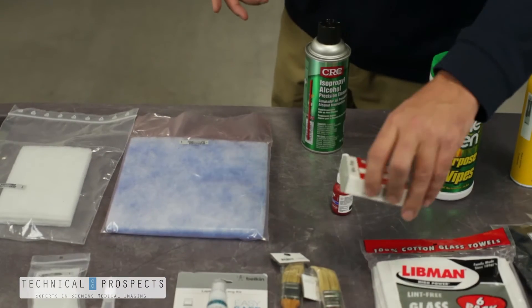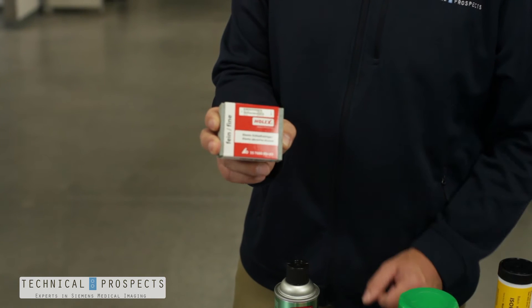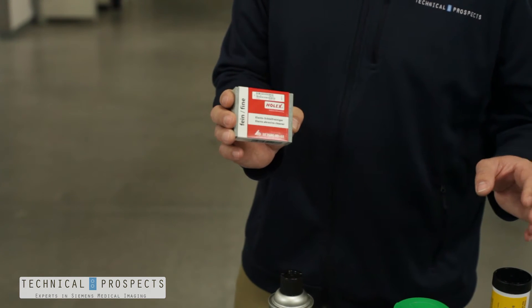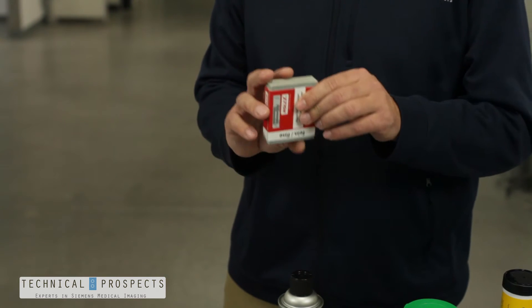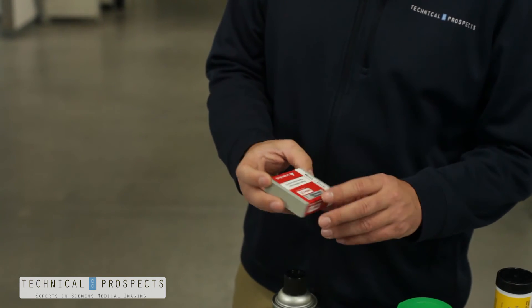A great tool for a Siemens scanner is this abrasive cleaner. This helps you clean the slip ring material. One thing that is common in Siemens CT scanners is buildup from the carbon brush assemblies. Over time, that will build up on your slip ring. Using this abrasive cleaner to help clean those contacts will help keep your system up and running.